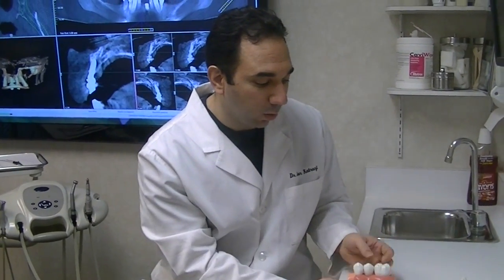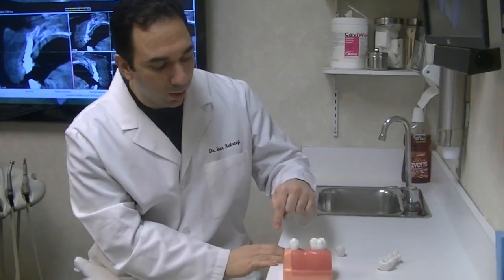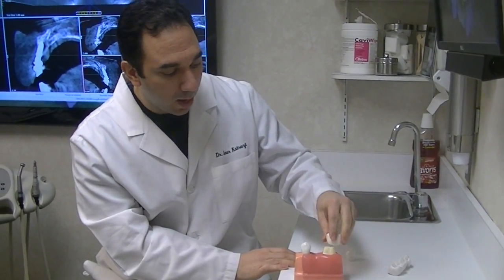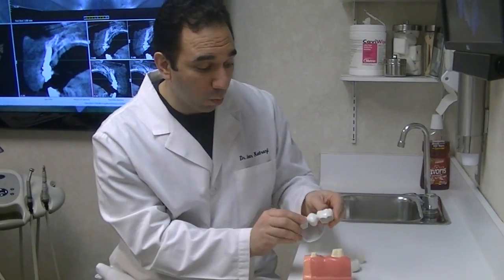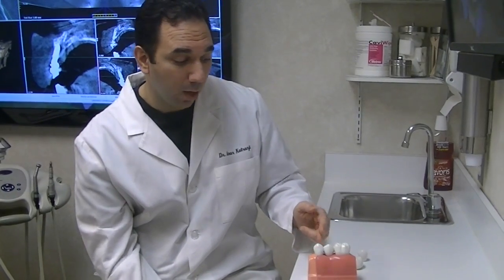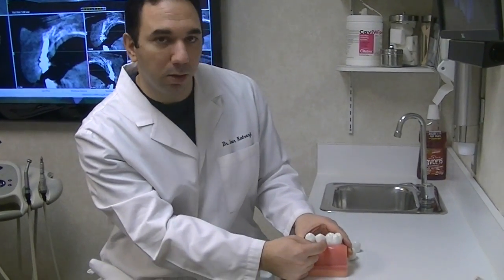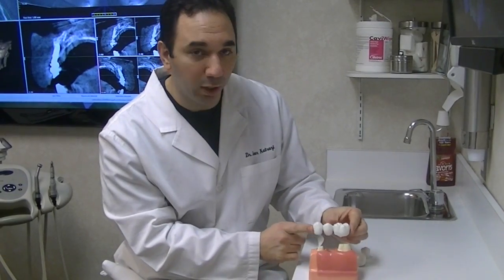If you decide not to do an implant, another option is a bridge. A bridge is when they take the teeth next to the space, cut them down, and create a bridge that goes from one tooth to the other to support a false tooth in the middle. The problem with this is you cannot floss between it, and in some cases we'll see decay occur in between those areas, and the tooth on either side might be lost because of it. If that happens, the whole bridge is lost.